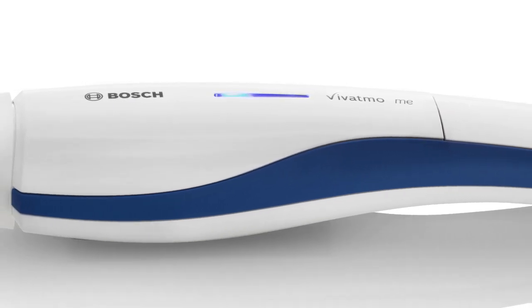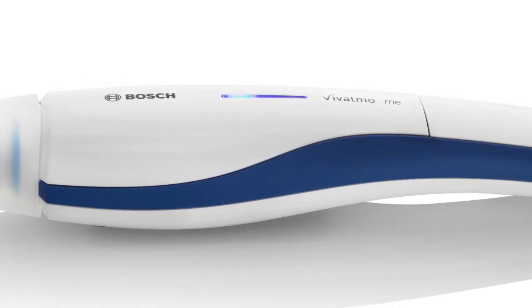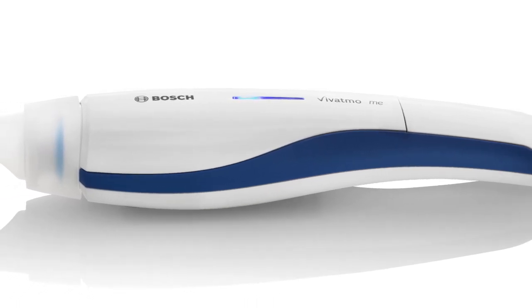With Vivatmo.me, the world's first FeNO breath analyzer for home use, you can keep close tabs on your asthma for the first time.